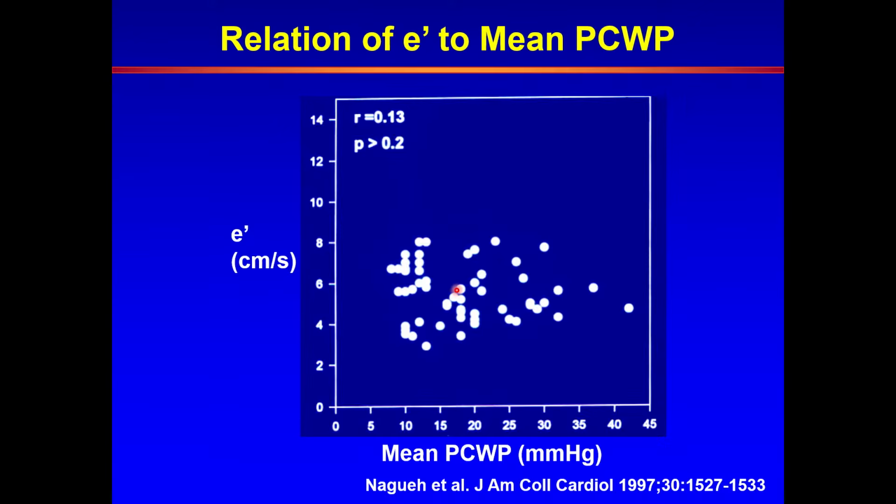Similar to that experiment that you saw, this was the original publication from here in 1997, taking patients, this time all of them with cardiac disease that had indications for cardiac catheterization with a wide variation in wedge pressure from 5 to 42, and you see that scatter plot similar to the experimental stages where relaxation was impaired, no relation with wedge pressure despite a very wide range.